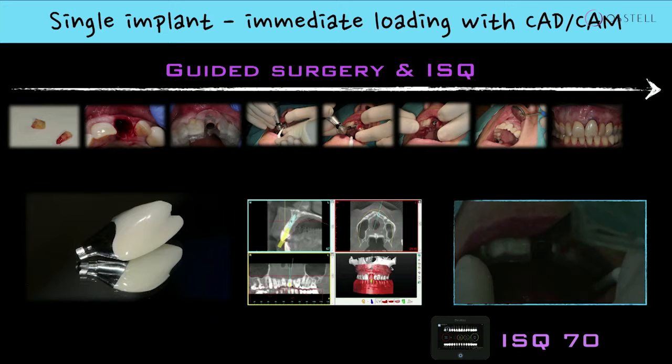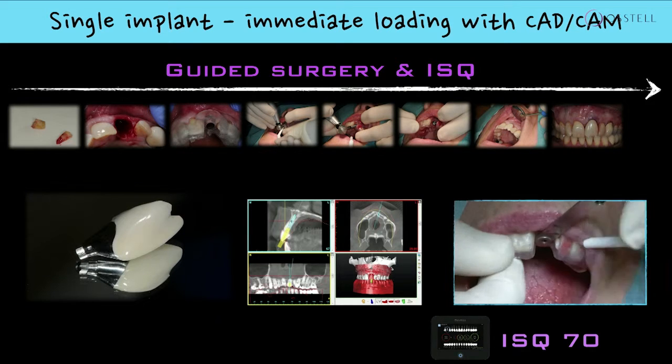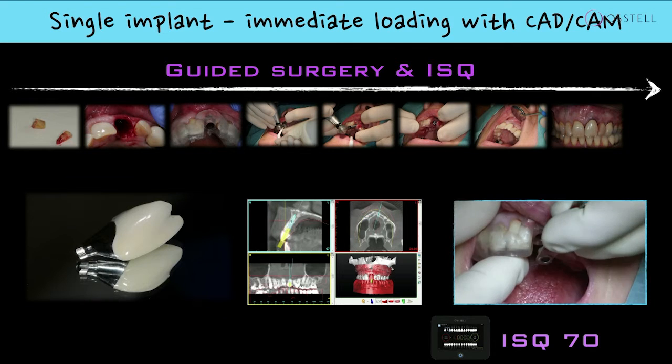So what we're doing then is walking from the time of extraction. We're placing the implant by means of a guide, and we are immediately loading that implant.